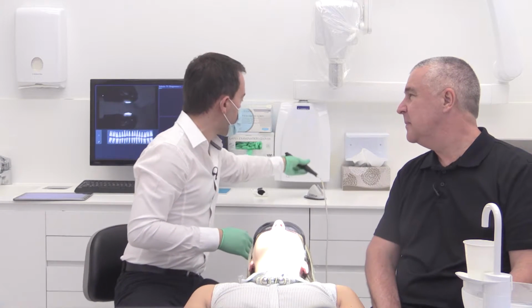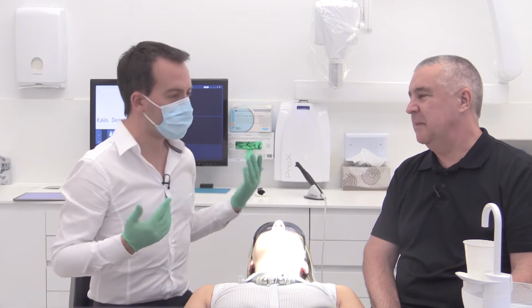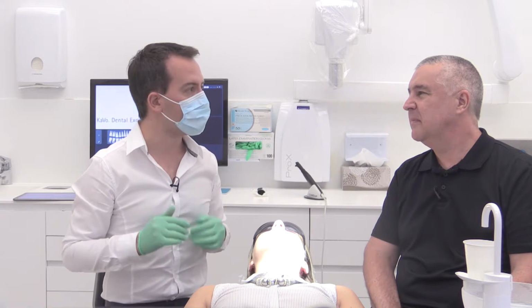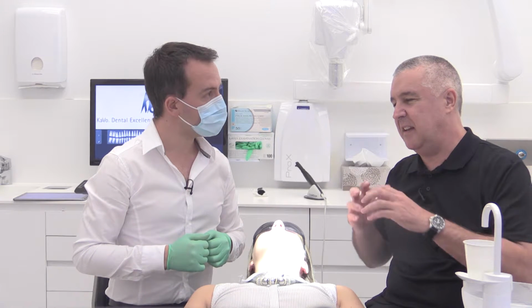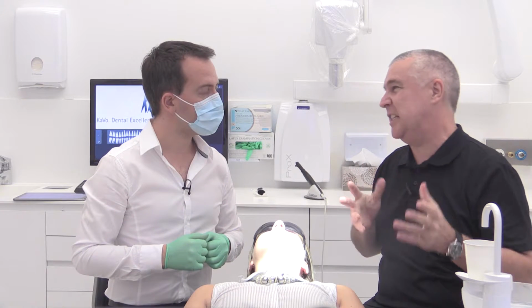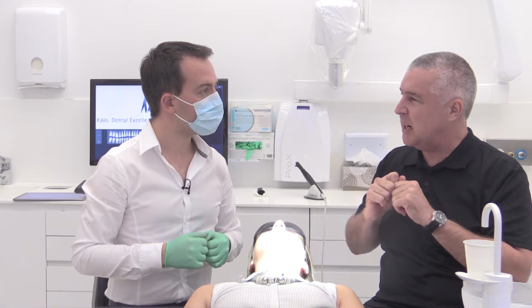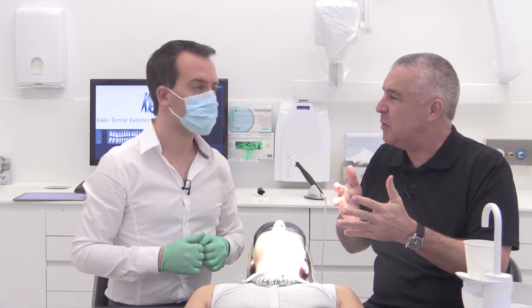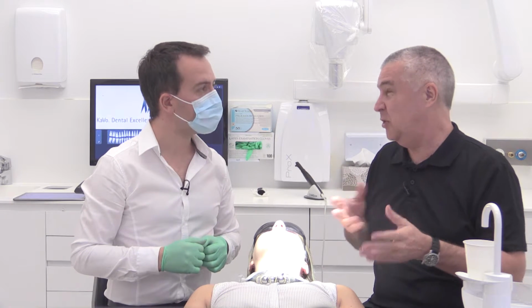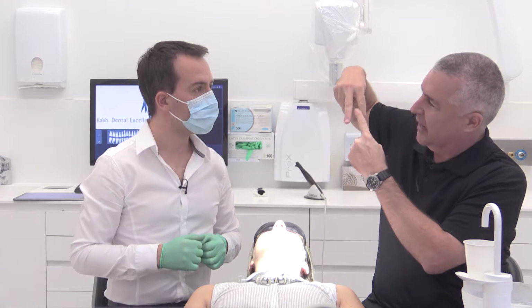And certainly I find that practicing on myself initially was probably the best way to find out how it's going to feel, but also work out the amount of pressure that I could use without eliciting any great discomfort. Yeah, I think that's one of the things that new users find is that they initially don't push it down far enough onto the occlusal surface, and they need to be comfortable that it's not actually going to hurt the patient. And it's actually designed to have a natural stop that brings it into position. And if you don't get it down far enough, then the image won't actually come into really sharp focus. So you'll soon find out if you just simply aren't getting it down far enough for those two little wings to engage the actual tooth.